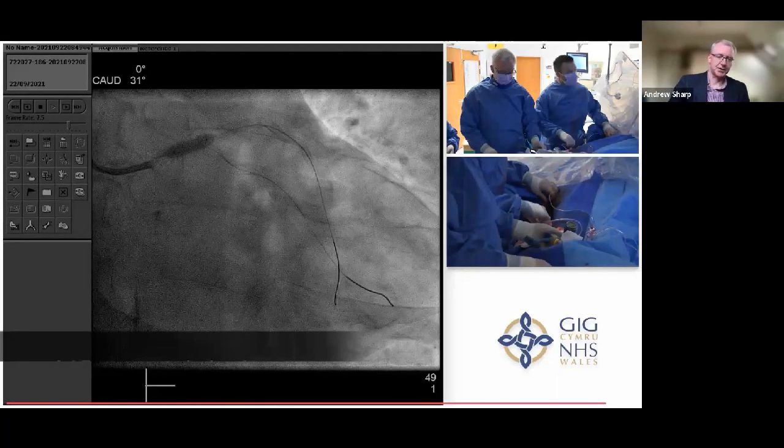And again, it's understanding what we're dealing with, that we've got about 8 to 10 millimeters of 5 to 6 millimeter LAD from the ostium. So it allows us just to make sure that we get right across those struts and safely go bigger than we normally would just on the basis of angio guidance. We'd never take a 5.5 into the ostium of this LAD without knowing what we're dealing with.